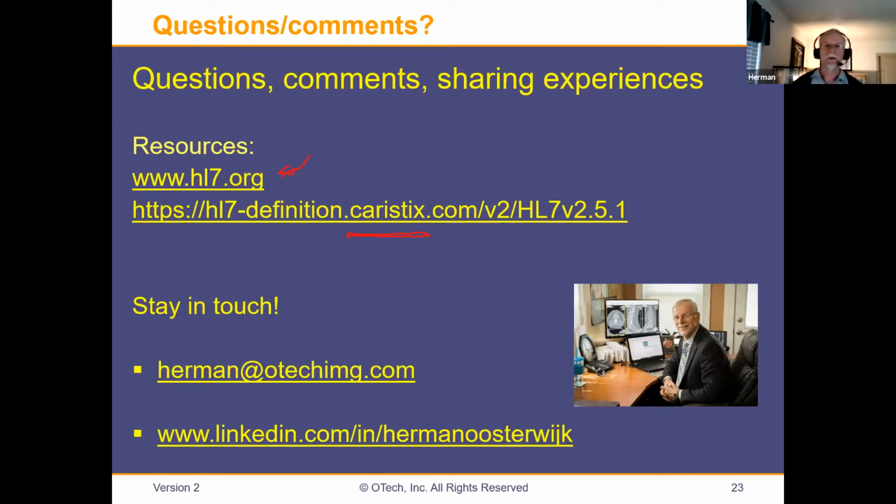What I use as a modality worklist provider is by Conquest. Of course, it's my favorite PACS because it's developed by the NCI, the National Cancer Institute in Amsterdam in the Netherlands. But it's very, very useful. It's a limited modality worklist provider. As a matter of fact, I was using it again earlier this week to test one of the new devices, and they couldn't get it to work. So it's a modality worklist provider, somewhat limited. Conquest installs in literally a minute.